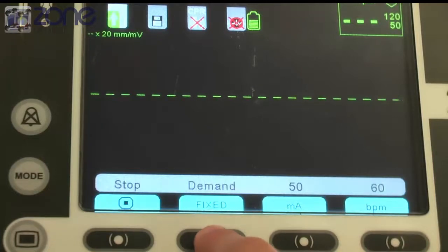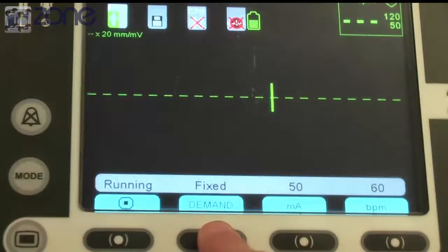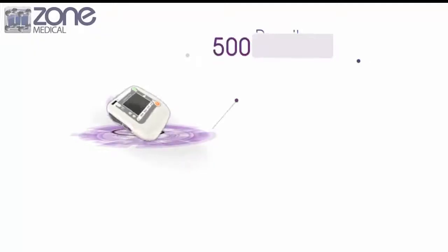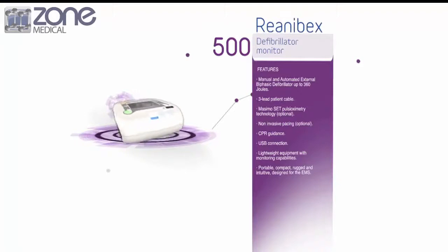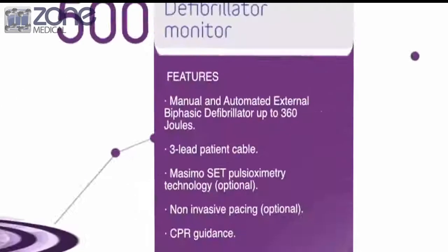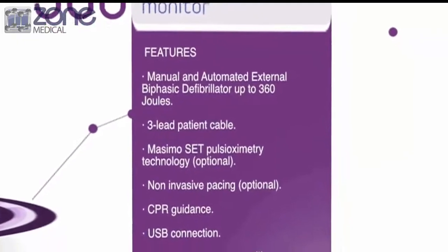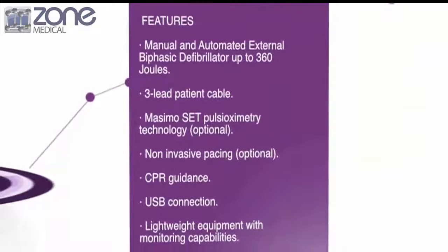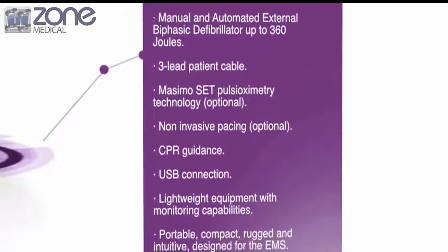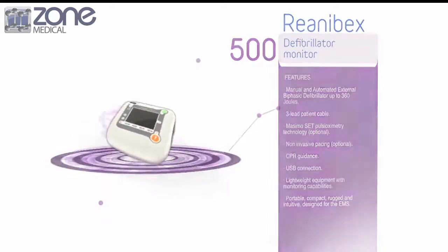Lastly, you can monitor patients by putting them into monitor mode or changing it back to AED. There is also an auto training mode on the Renibex 500 that is designed to train people to use the automatic external defibrillator. This option allows users to familiarize themselves with the use of the Renibex in any emergency situation, and it also allows them to see any different symbols so they can use this knowledge in different scenarios.